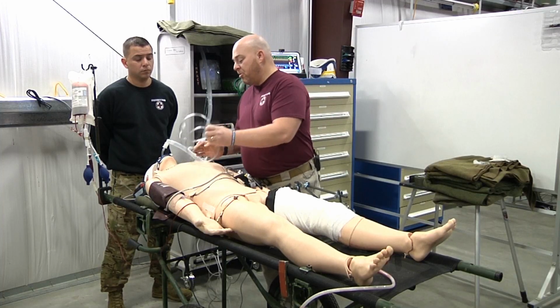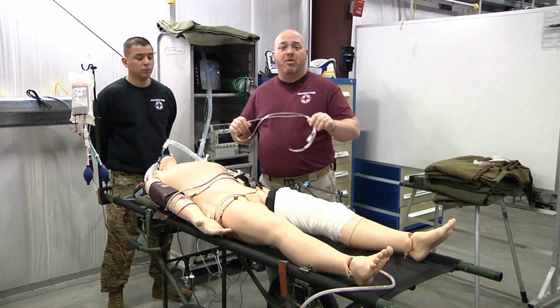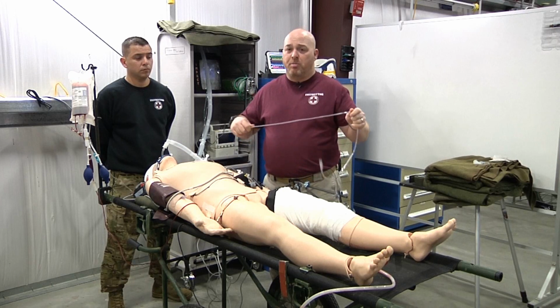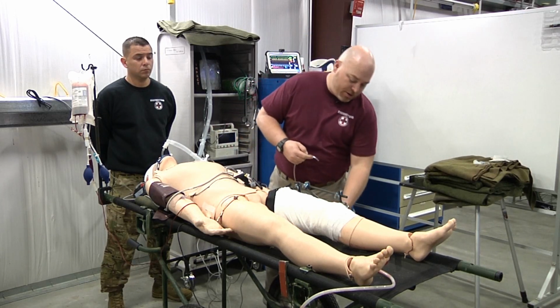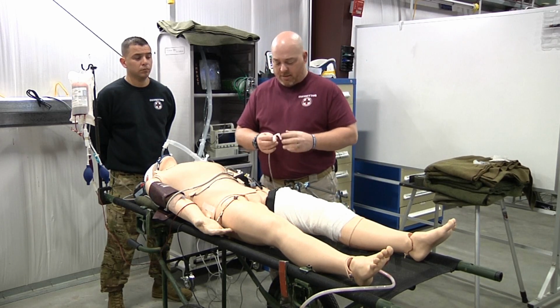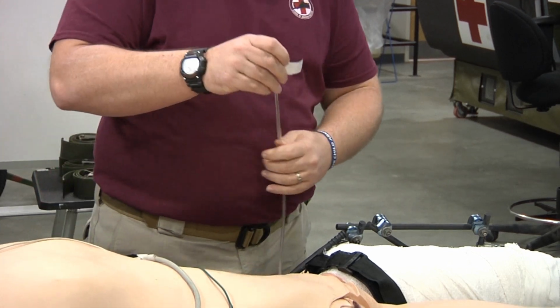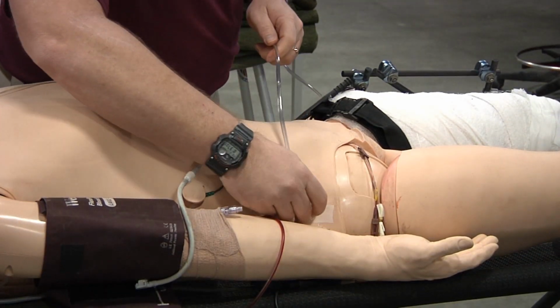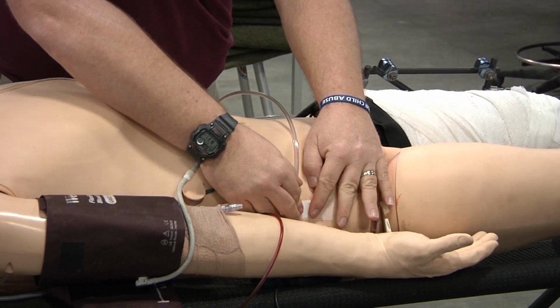The other thing that we're going to do is grab any type of tubing that we have: oxygen hose, NG-OG tube, extra IV tubing, cut to size, whatever you want to do. And we're going to mark it or flag it using this tape, and we're going to set it up here, getting it on our baseline marker.